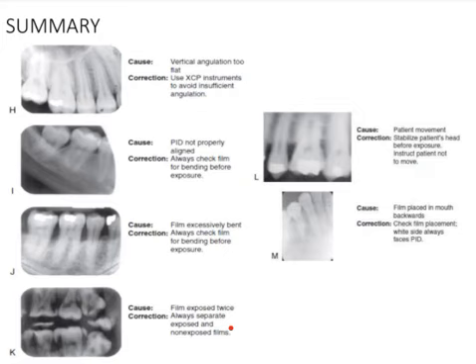So in such a case, you can see that there are teeth that are exposed more than one time. For example, if you see here, there are two outlines of the same tooth. You can see one outline here, another outline here, and the main area of the tooth is here. So that is called a double exposure.